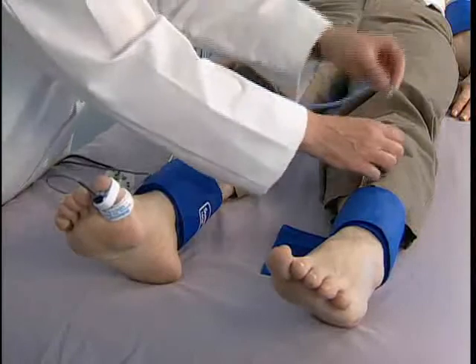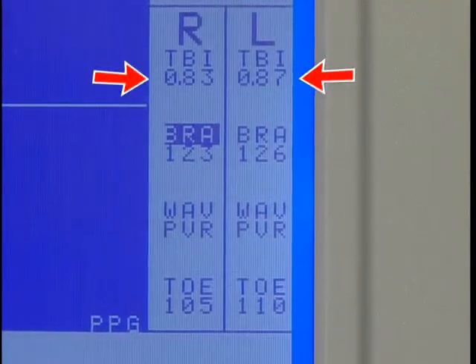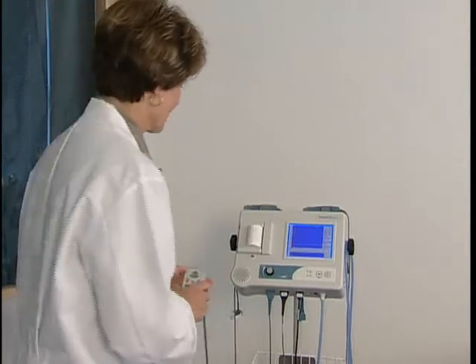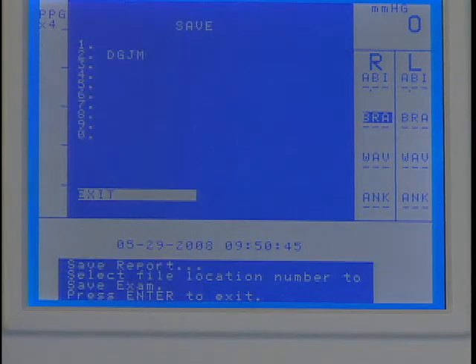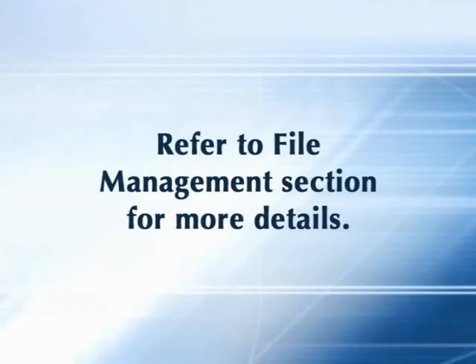Continue these steps for the remaining sites to complete the exam. At the end of the exam, the TBI results are calculated automatically. After completing the exam, press Print and apply the adhesive backed labels with the exam results onto the report form. Or save the exam to one of the ten storage locations as explained in the file management section of this video. Thank you very much for watching.